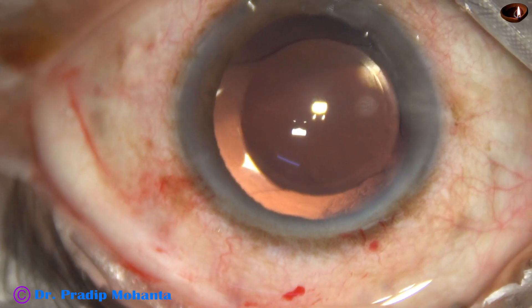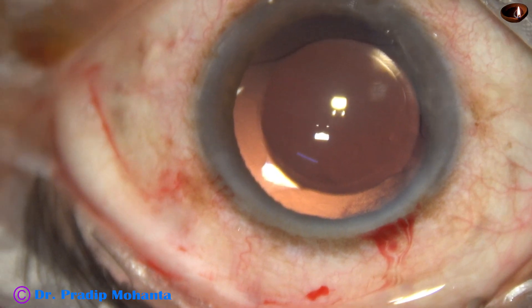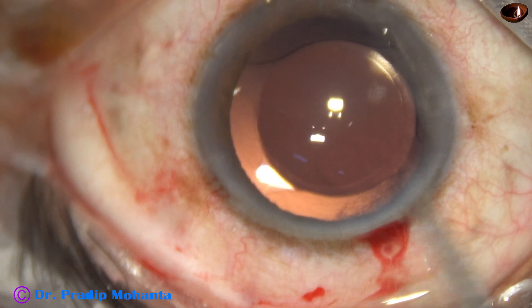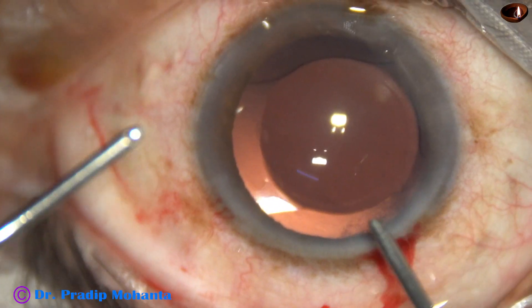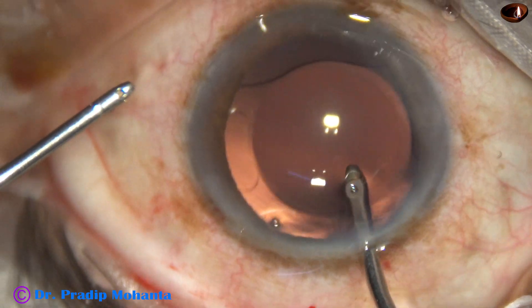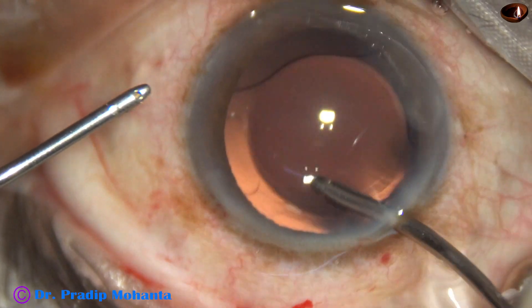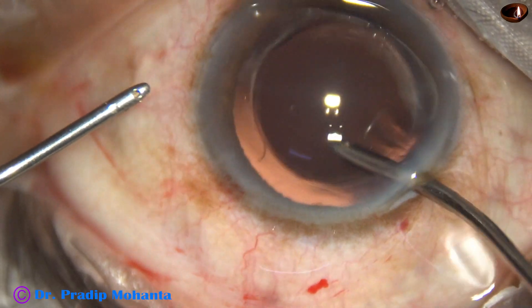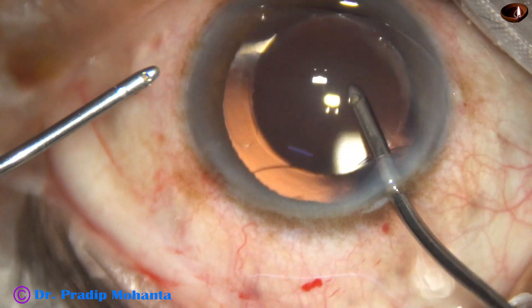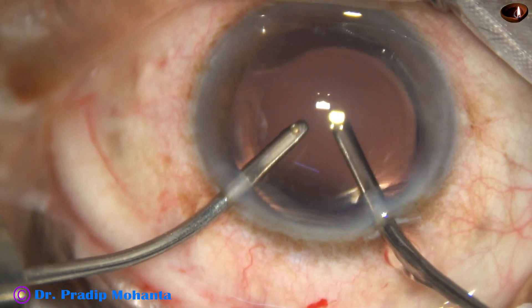What the intuition tells us to do a maneuver for safe surgery — I think we should listen to that. It may take a little longer time, maybe a minute more, but we should listen to our intuition for the safety and better results of the patient.